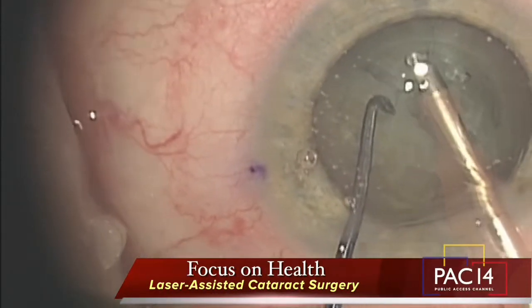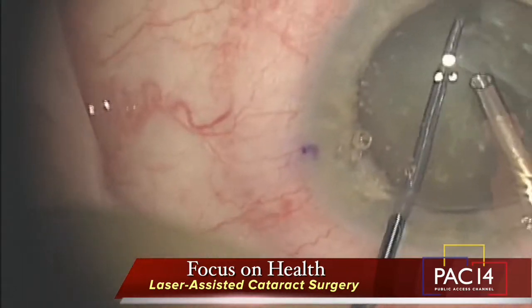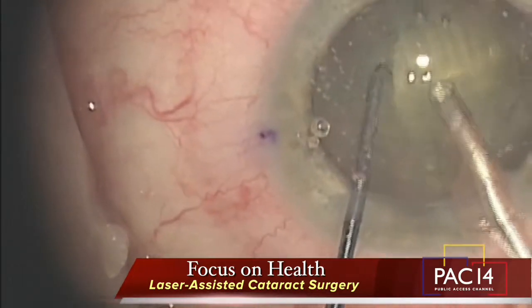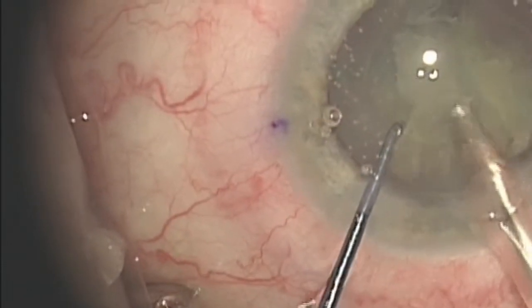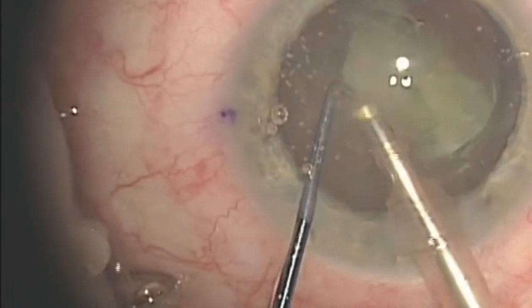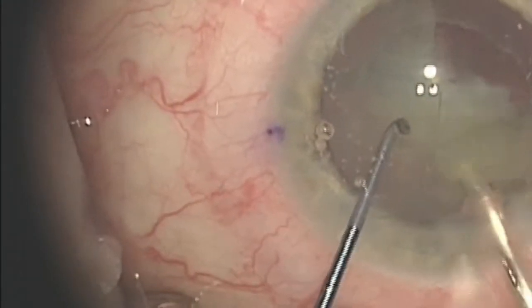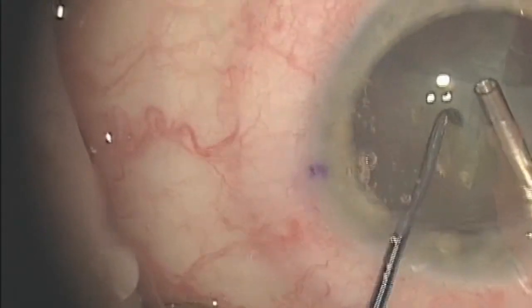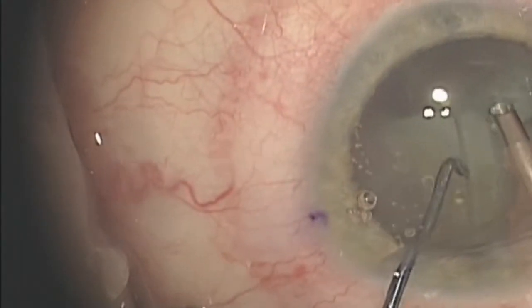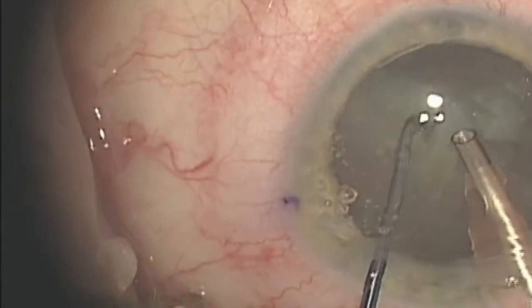Now I asked for quad, please. I'm asking our surgical scrub assistant, please change the machine settings to what I like. I could do it with a foot switch actually, but a lot of times I get them to manage it so they can see what's going on now. Notice that's coming out just like a big old quarter. I'm not using very much power here. I'm taking out those little sections of cubes. Those little sections of cubes have softened it up, broken it up. I've done, like I said, a good portion of this work for us.